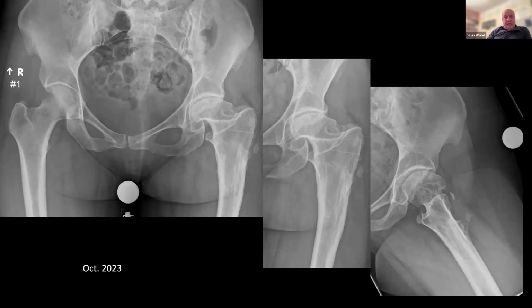Thanks, Jason. Yeah, so clearly Perthes disease as a child, she's got a short neck, large flat head, kind of incongruent, because of the failure of growth on that side. You can see the GT and the lesser trochanter are abnormal. There's a big flare of the metaphysis, the bone quality, and the bone is probably underdeveloped on that side, probably as a result of the pain. So it's probably a degree of disuse osteopenia if you compare it to the cortices on the right hip. So you've got all kinds of problems here.